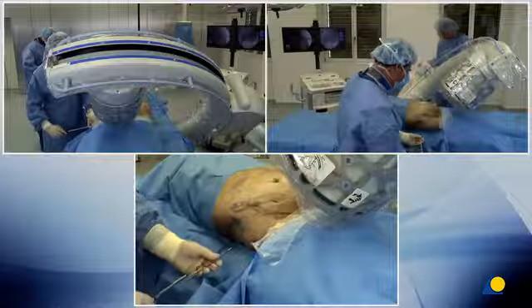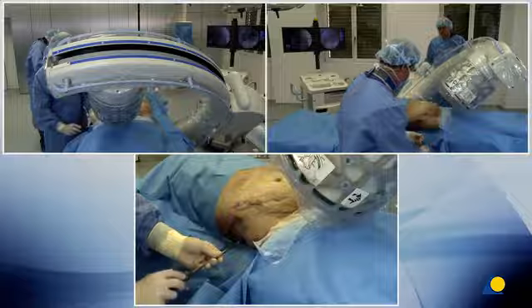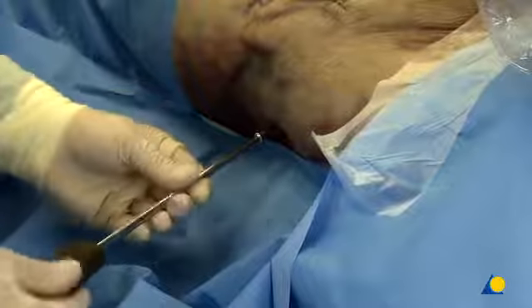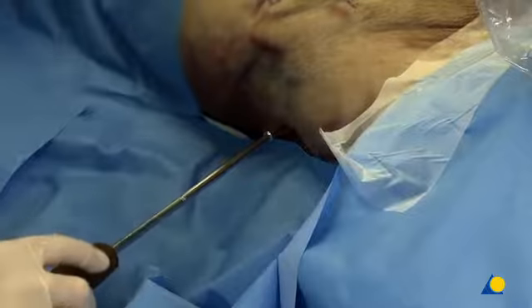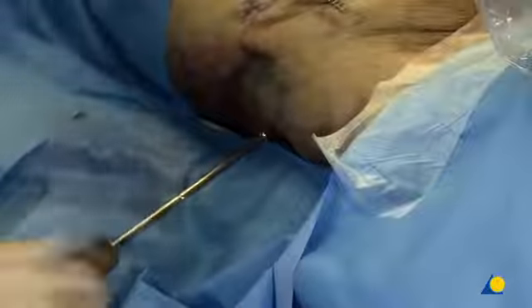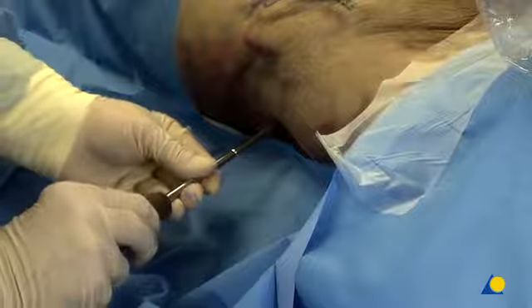The screws are usually self-drilling screws, so unless the bone is extremely strong, the screw may be inserted without pre-drilling, which gives a better purchase. It is important to carefully tighten the screw to avoid intrusion of the screw head into the ilium and loss of purchase. Using a washer can avoid this.